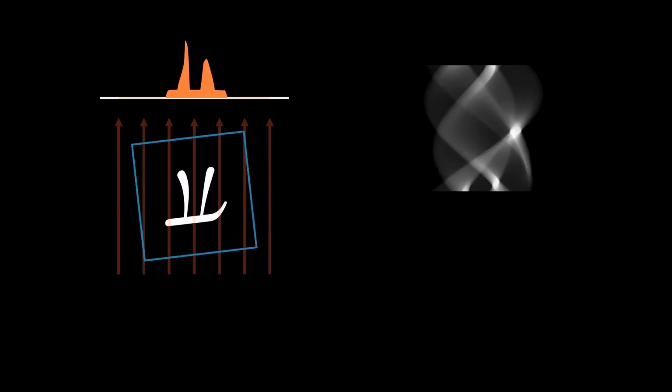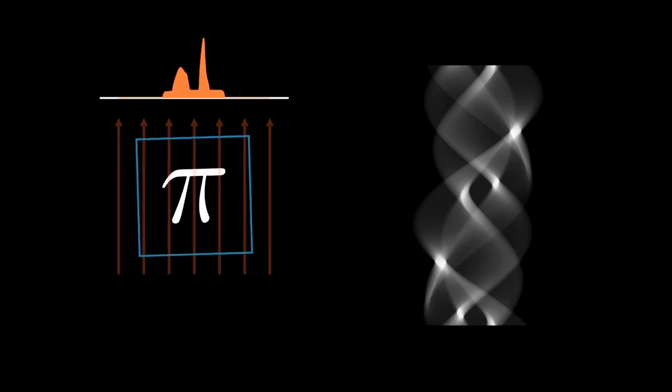To understand these sinograms intuitively, let's go through some simple shapes in the object space. First, we have a small disk close to the center of the object space. Its result is a thick and tube-like sine curve in the sinogram. The intensity of this tube is higher in the middle of the sine curve than on its edges, as less X-rays are absorbed at the edges of the circle. Moving the disk further away from the center, the amplitude of the sine curve increases.